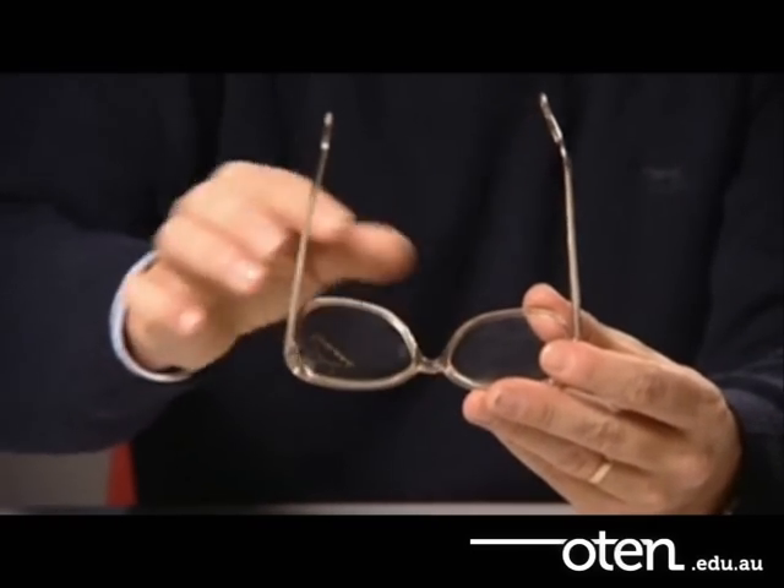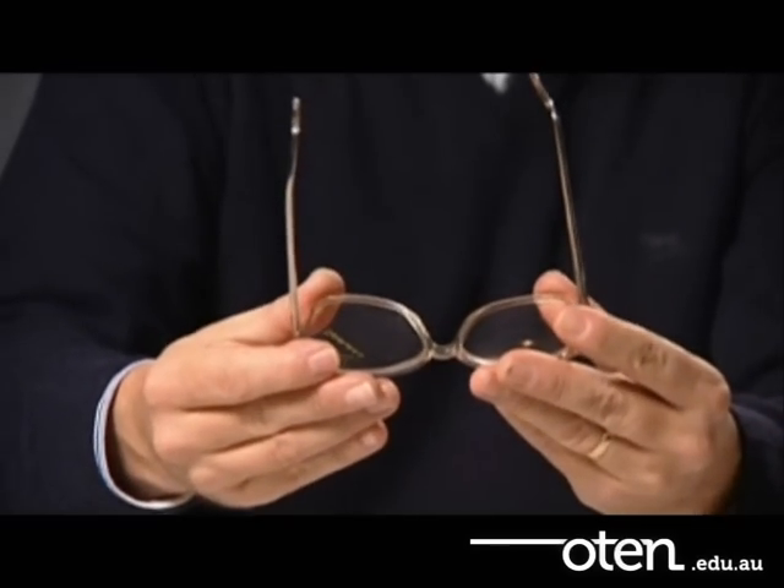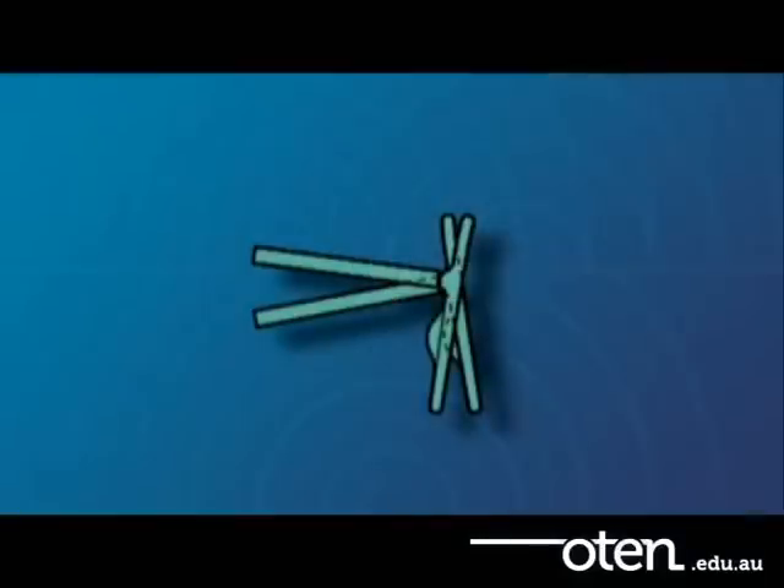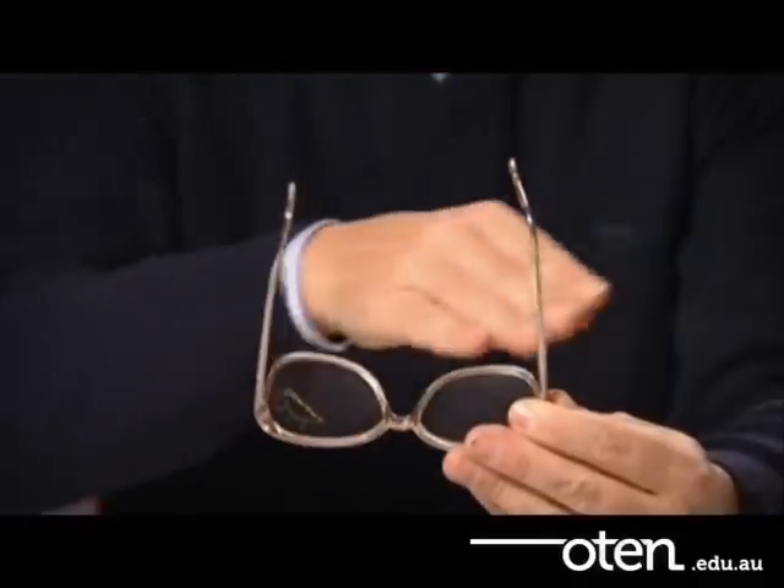Look for two possible errors. Is the bridge twisted? This is known as X-ing because it causes the eye rims to form an X when viewed from the side. This needs to be straightened.